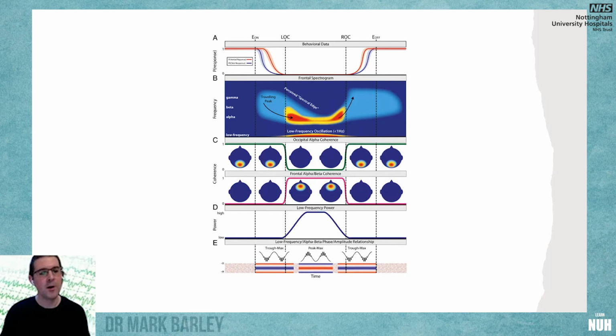So, a wonderful example is at the end of the operation, you say, open your eyes, and the patient opens their eyes, but just moments, seconds before, the scrub nurse has dropped the tray of instruments and the patient hasn't stirred, and that was far louder. So we see this every single day. It's why asking the patients to open their eyes will elicit more of a response than dropping something.